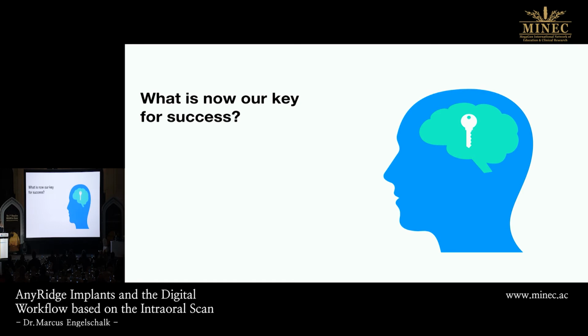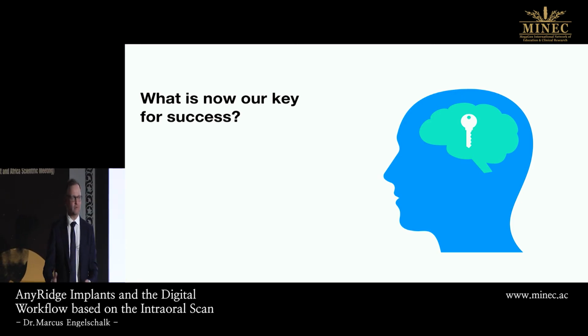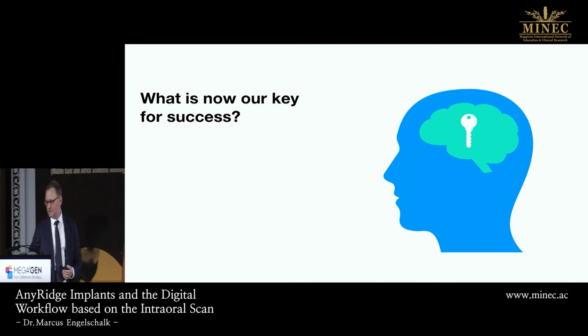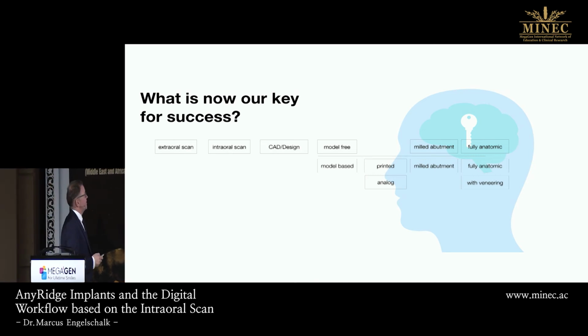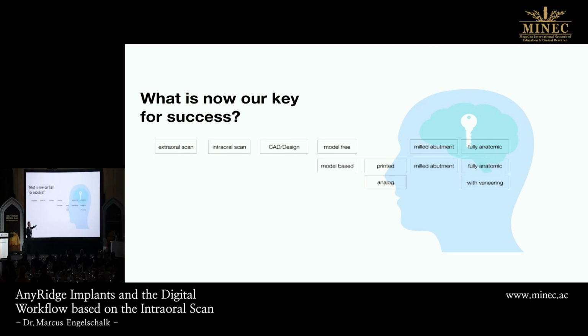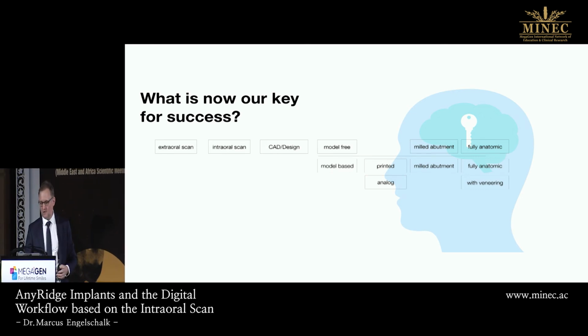Okay, what is now our key for success? So many questions, so many new things. I want to give you something like a cookbook, a take home message, as always called. Well, at first, if you have a look, you get an extraoral scan, you get an intraoral scan, you CAD/CAM design, model-free, model-based, printed analogs, milled abutment, fully anatomic, veneered. There are a lot of topics. I want to give you a little bit an order.